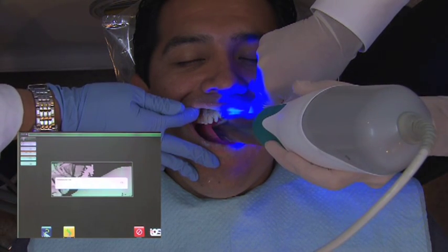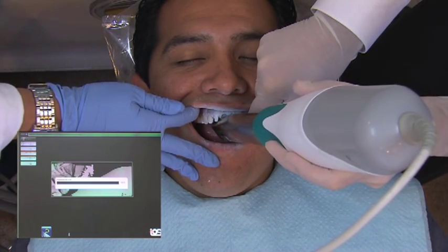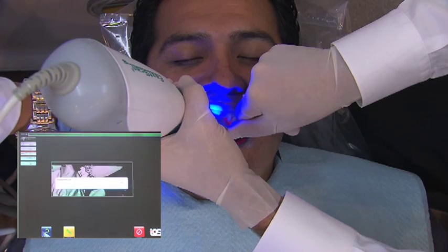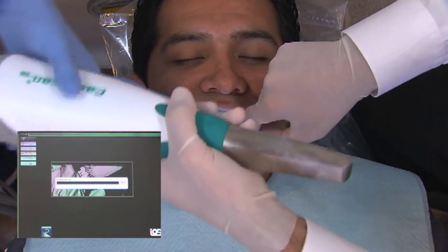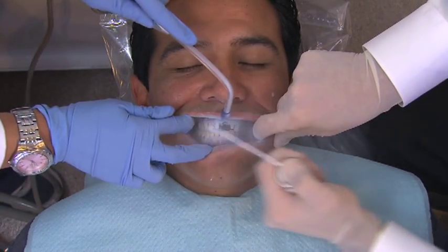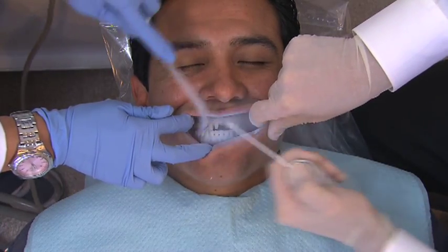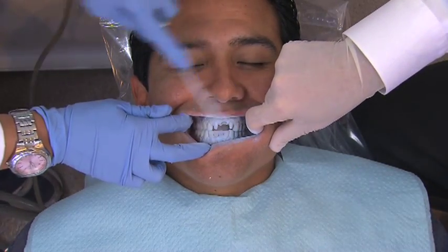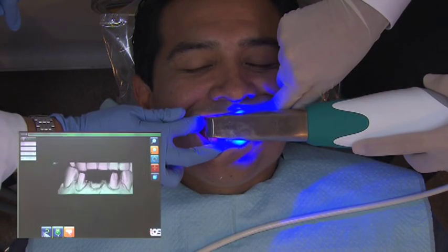I'm going to do two extra scans — bonus scans that don't necessarily need to be done. I'm getting the proximal contacts on the teeth next to the two prepared teeth. Some dentists skip this step, but I just like giving lots of information to the lab techs. That's what happens when you practice inside a dental laboratory — you begin to see pretty quickly what lab techs like, and it's usually more information, not less.